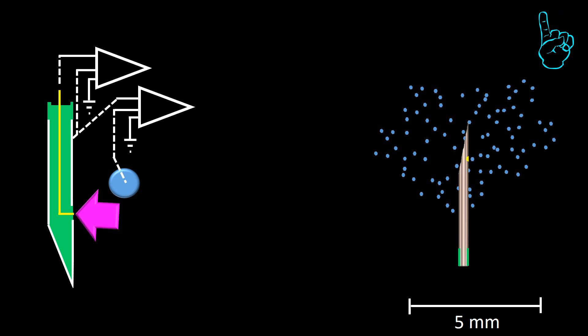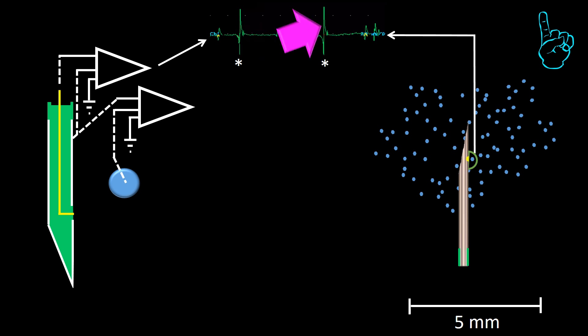One perspective is from that of the thin electrode referred to the distal cannula. This perspective samples a very small area and produces a tracing where isolated single muscle fiber potentials can be viewed. In this particular tracing, judging by the shape of the potentials, we can count four different muscle fiber potentials but only one of good configuration and significant amplitude as you can see here and here. We will refer to them as prime potential.